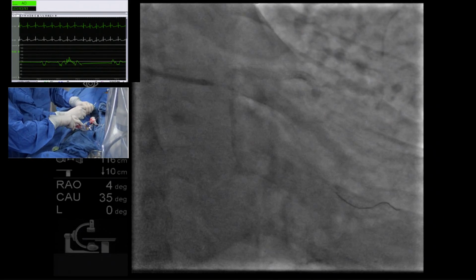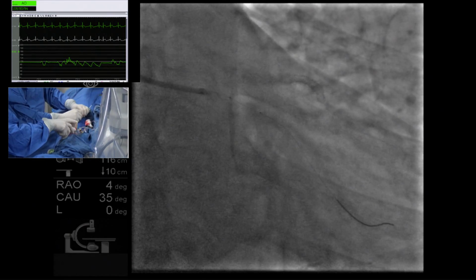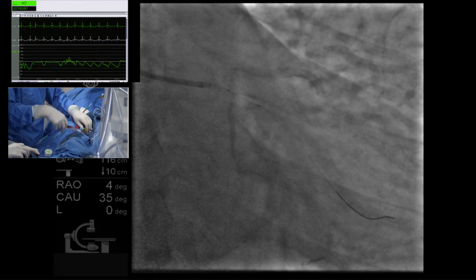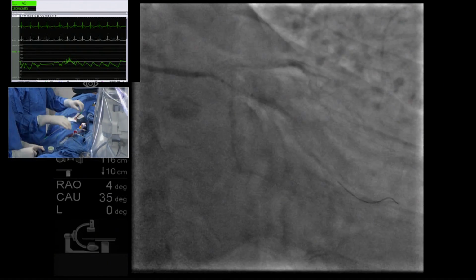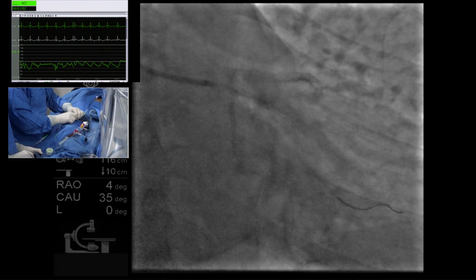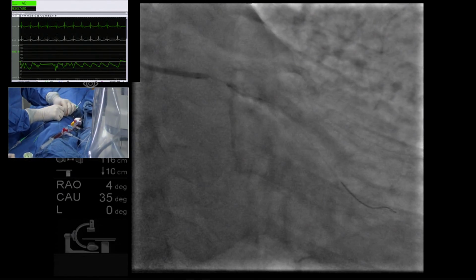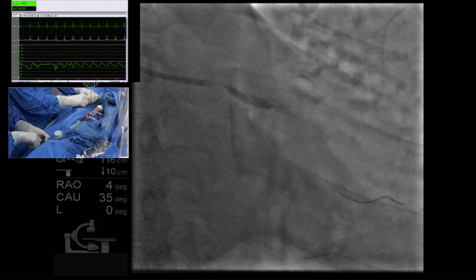Some slow flow, then ST changes. Okay. Let's go up. Let's puff there. Puff a little. Should I go up? Yeah. Let's see. There. Go up. Yeah. 6. So we're going up. 8. Oh, okay. 9.